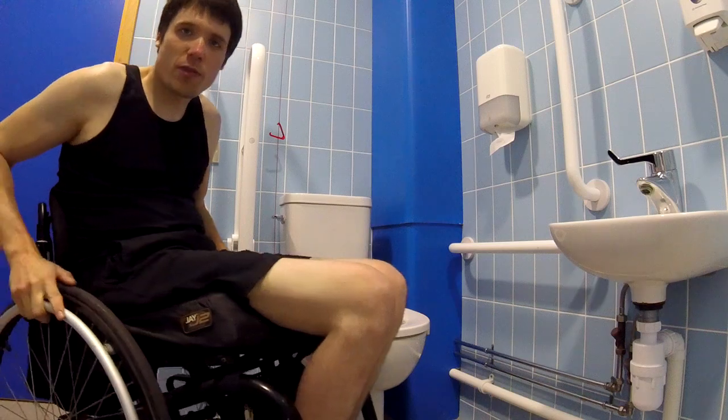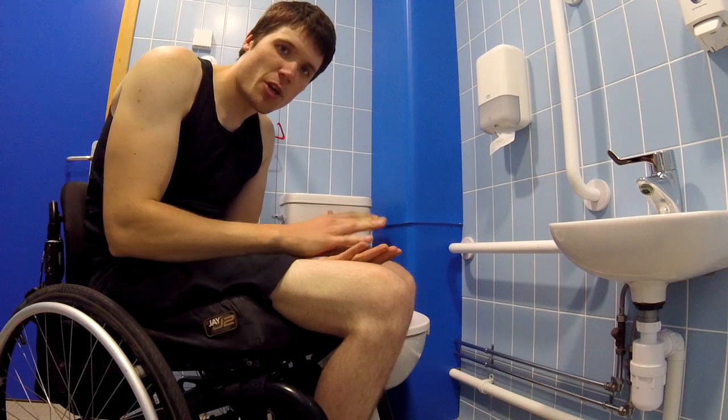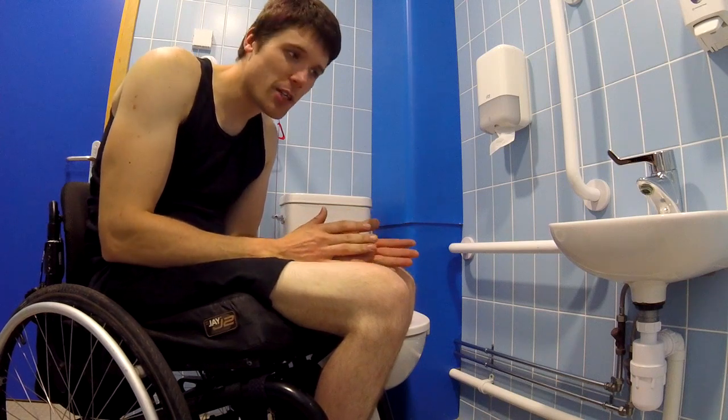Now there are a couple of other setups, and I will try and find some to put after this video just to show you how they work, but they are very similar.